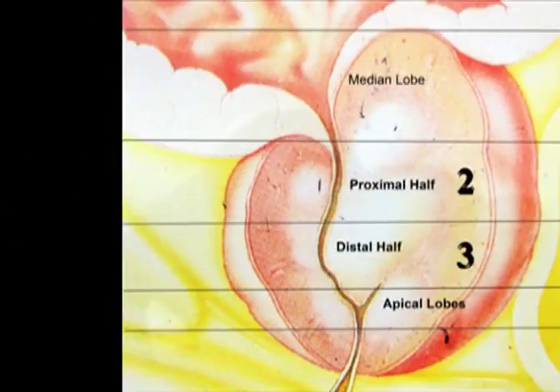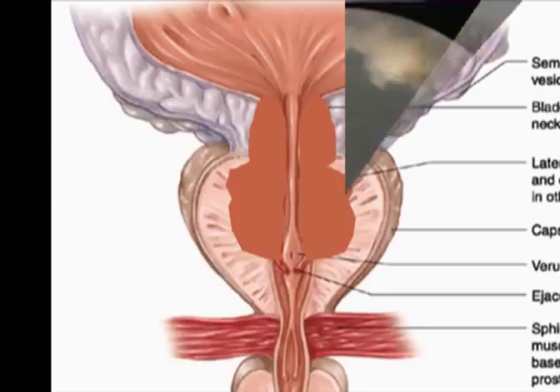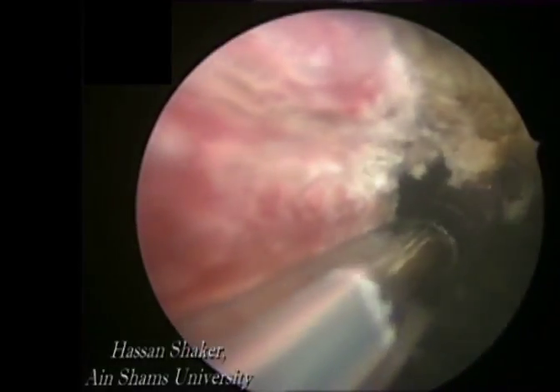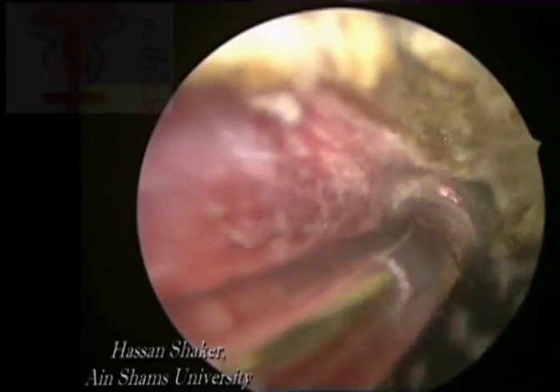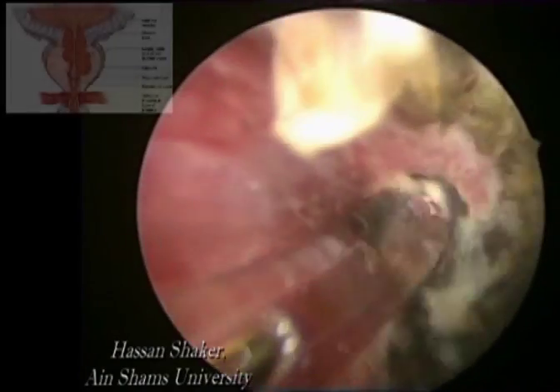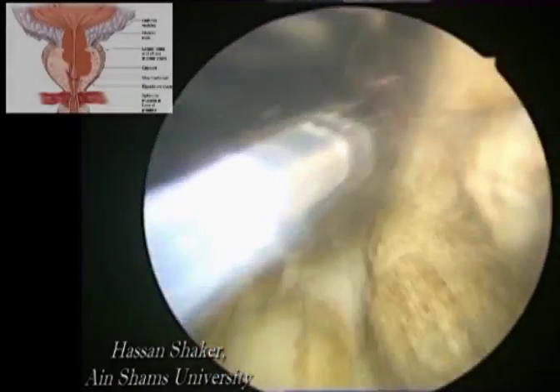The same process is repeated on the right lobe. We start by the proximal half anteriorly, working our way posteriorly, ablating the tissues in layers until the surgical capsule is reached. It is not advisable to reach the capsule in one area before the others, otherwise the prostatic lobe will fall and will be unsupported, making the ablation process more difficult.